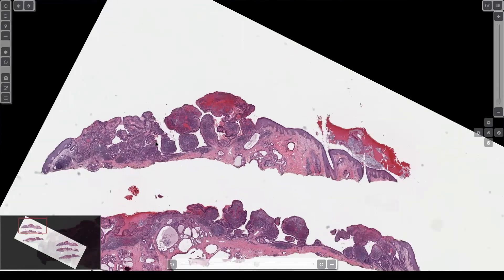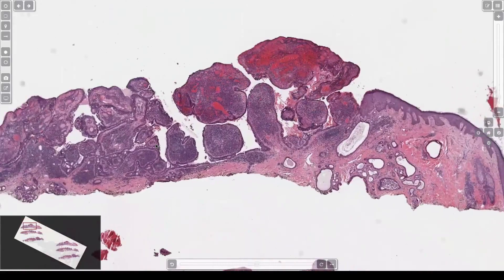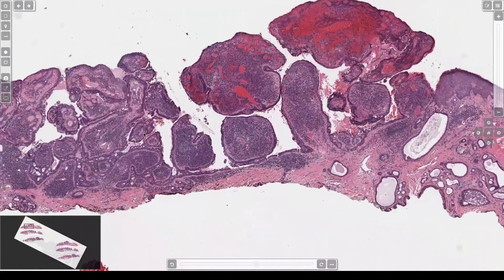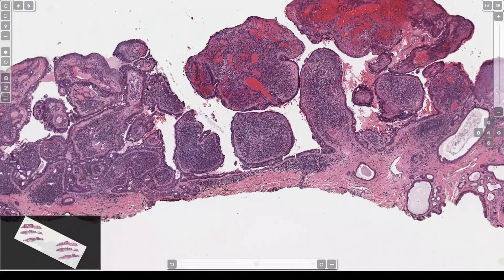For those of you who are more junior residents, papillae mean finger-shaped structures. Like this thing is kind of finger-shaped — it goes up and down — but these are also finger-shaped, just cut in cross section, so you can't see where they connect. Floating islands that are lined on the outside by epithelium sitting in a space — that's papillary.